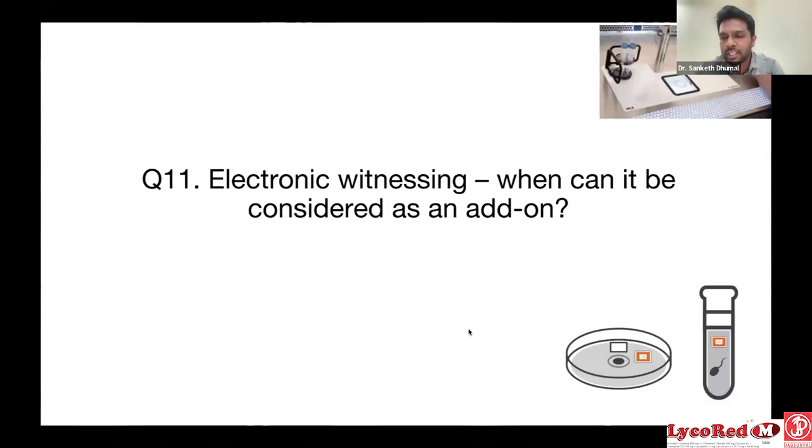And yes, initially there are little hiccups with this system. But still, when multiple people are handling multiple samples, I think it is worth it, because we as humans tend to make mistakes, and you're putting a checkpoint there with this electronic witnessing. That is what I would like to say.